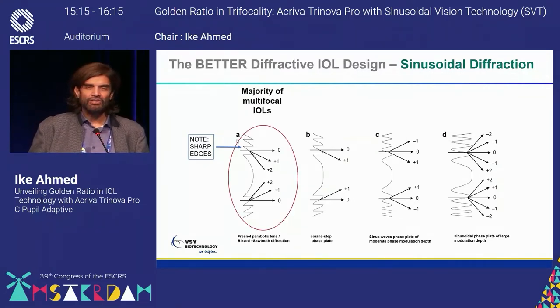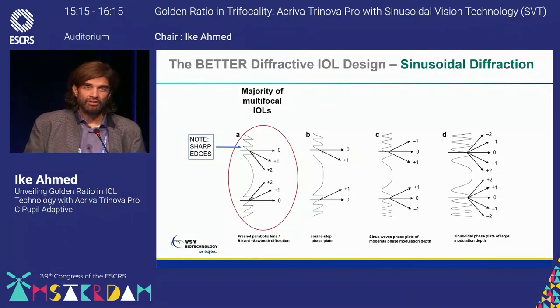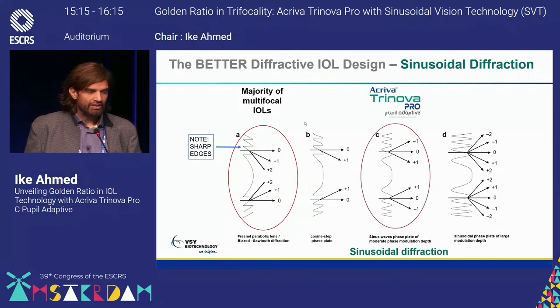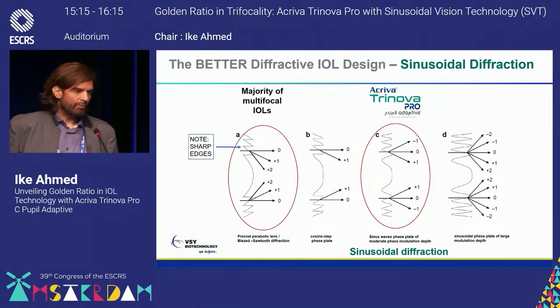Here you see the classical blaze or sawtooth diffractive pattern. Notice the sharp edges. This, of course, does create bifocality. It also creates zero, first, and second order wavefronts. And these potentially can also cause scattered light and dysphotopsia and loss of contrast and transmission. Remember that point. It's very different with the gentle sinusoidal diffractive pattern you can see here, with the minus one, zero, and the first order wavefronts here.